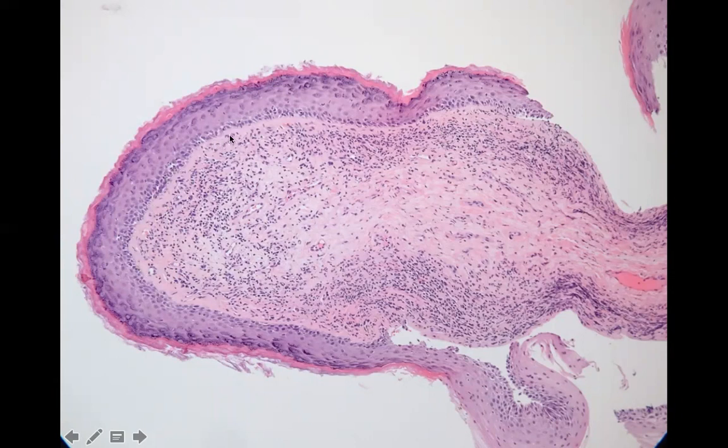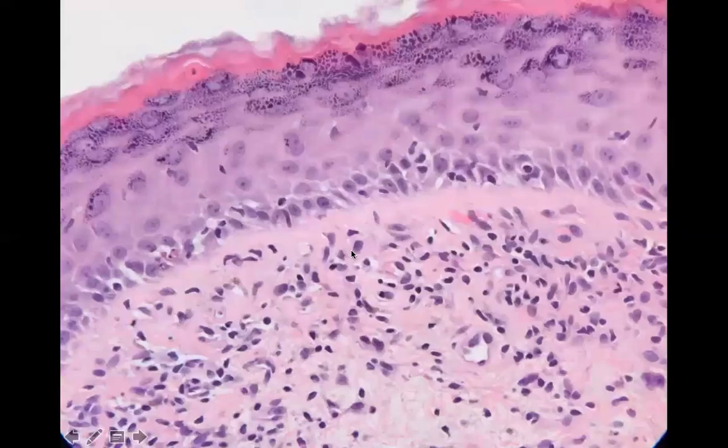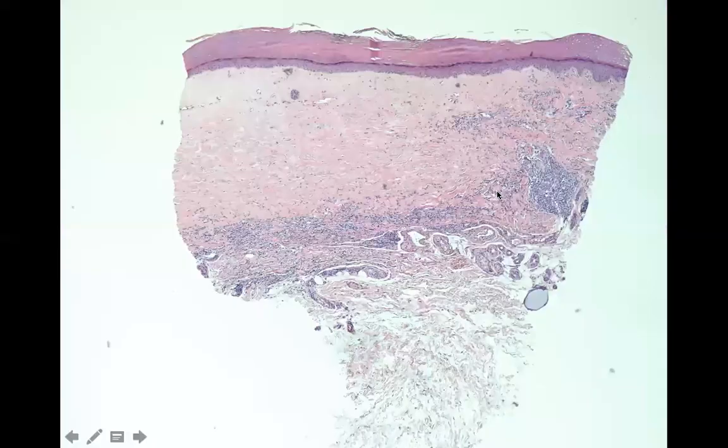There's increased collagen filling it in, and there's a relative decreased number of fibroblasts, and that's why it looks so homogeneously pink. So early lichen sclerosus. Looking up close, here's your necrotic keratinocyte, here's a lymphocyte causing your interface, here's the rest of your lichenoid band that's moving down with your melanophages, and here's this pink sclerotic zone that's being left behind.